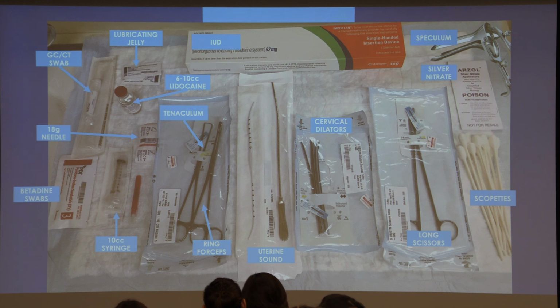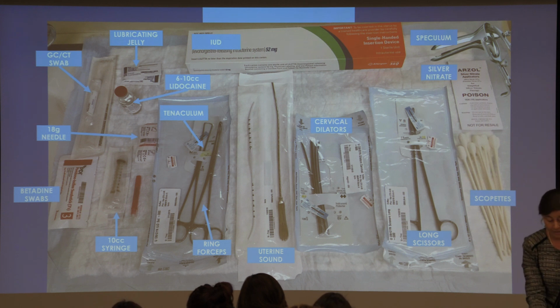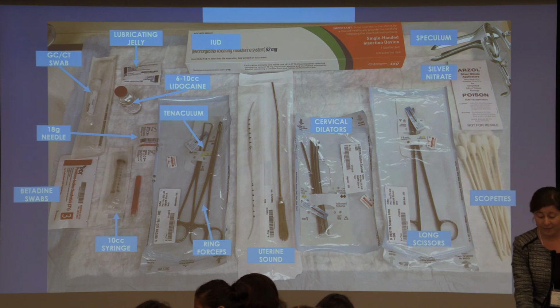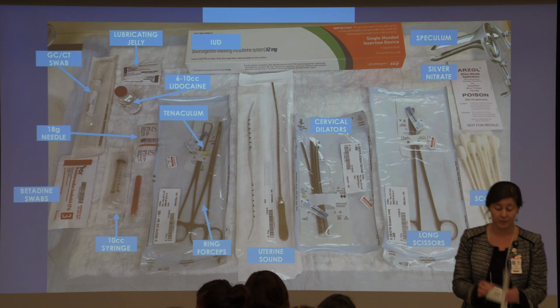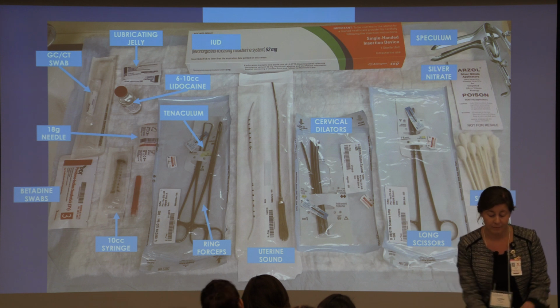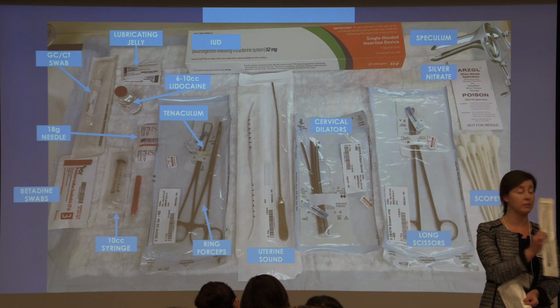We want, if provider preference again, available lidocaine. So again, just needing a 10 cc syringe. We need an 18 gauge needle to draw up, or at least something to draw up the lidocaine. And then we use spinal needles, a 25 gauge 1 1/2. We need a tenaculum to grasp the cervix. Uterine sounds that are available. We have disposable uterine sounds. We do have our metal uterine sounds, those that we can sterilize.